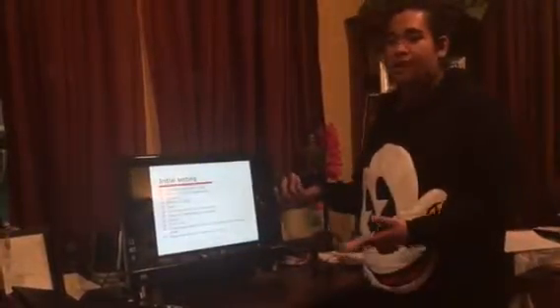And we're now shifting gears and going into initial settings. So our initial setting is a tidal volume of 6 to 8 mLs per kilogram. Now that's for patients with normal lungs, and it needs to be calculated from the patient's ideal body weight. I didn't put the calculations on how to do the ideal body weight on this slide, so I'm going to tackle that towards the end of this lecture.